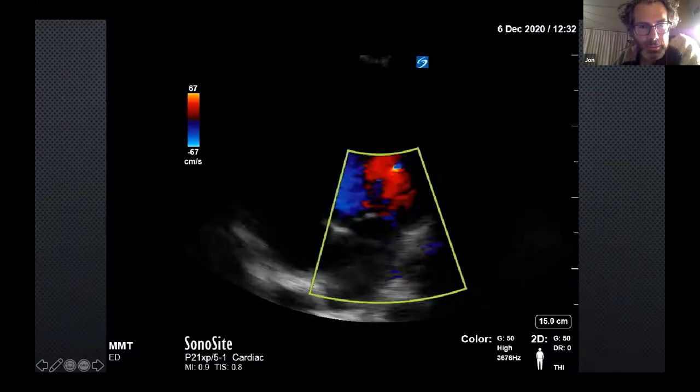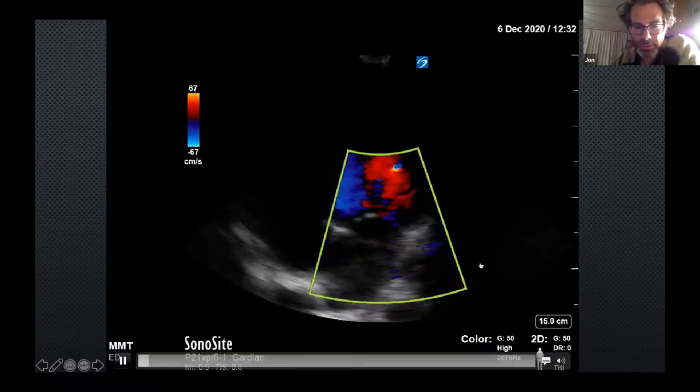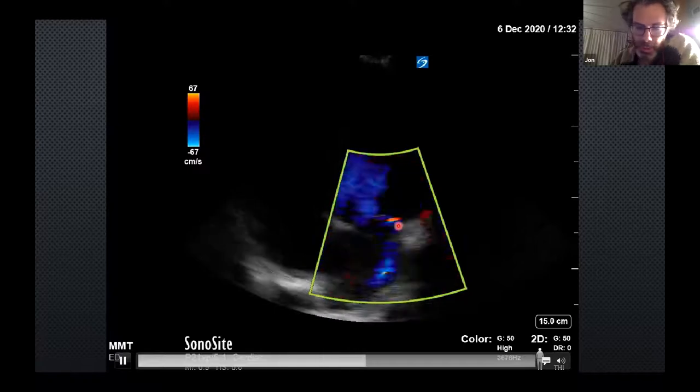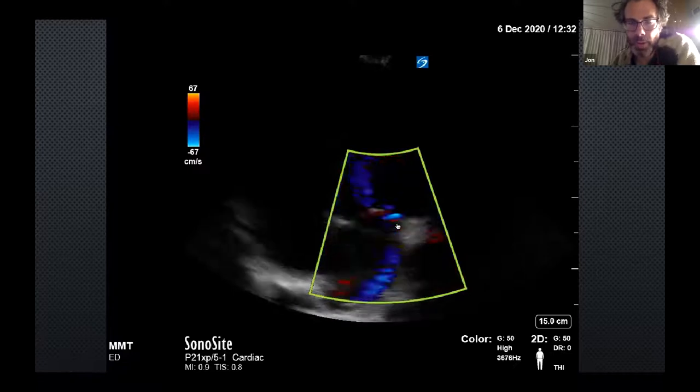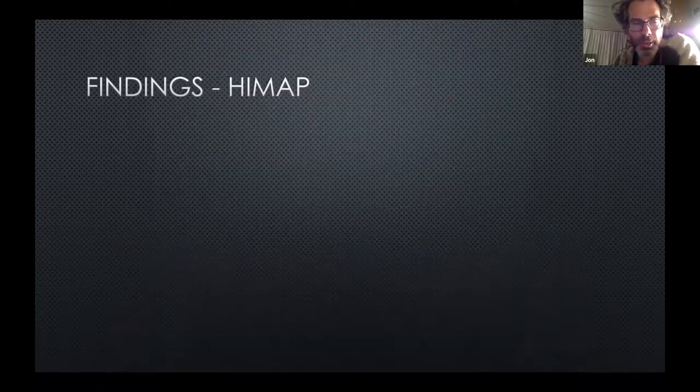And then color Doppler. So you put the color Doppler box over the left atrium, and we can see there's this little blue-yellow jet. There's a bit of eccentric mitral regurgitation, but you don't really need to do any of these advanced things. I think just from those basic two-dimensional views on B-mode, we've really got all the information we need, actually.